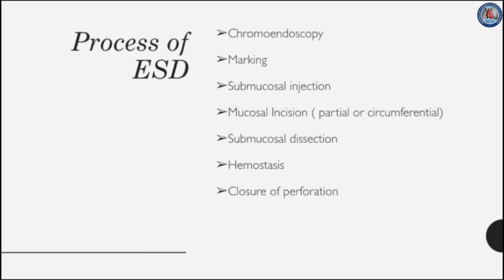Typical ESD is accomplished in a stepwise manner including marking the lesion, incision, and submucosal dissection with simultaneous hemostasis. Absolute delineation and definition of the border of the esophageal neoplasm is crucial. Chromoendoscopy using several dyes or NBI with magnification is often used for pre-procedural assessment. Once the margins of the lesion are fully visualized, argon plasma coagulation or an ESD knife using soft coagulation current can be applied to mark the resection borders with dots around the lesion.